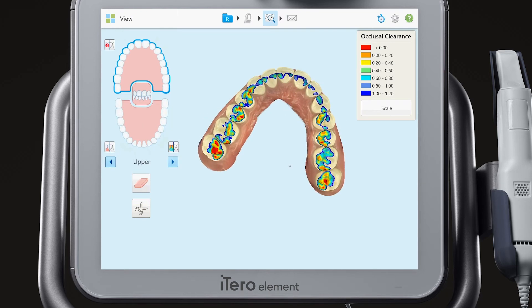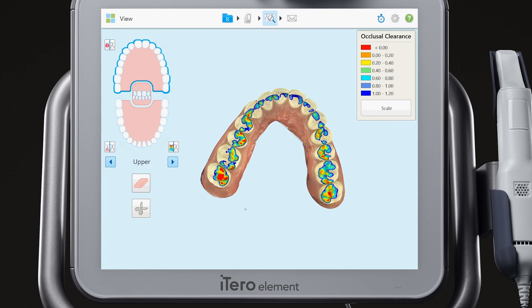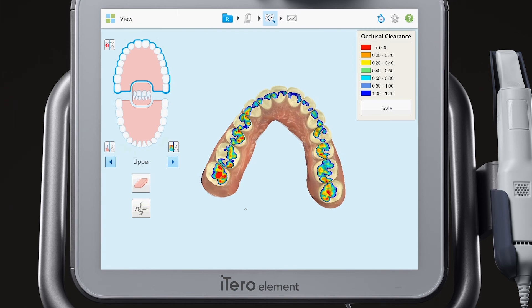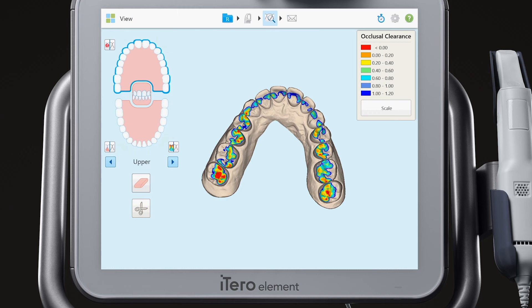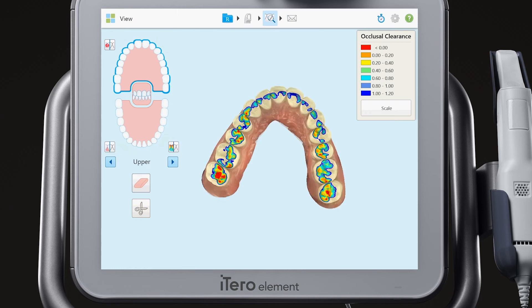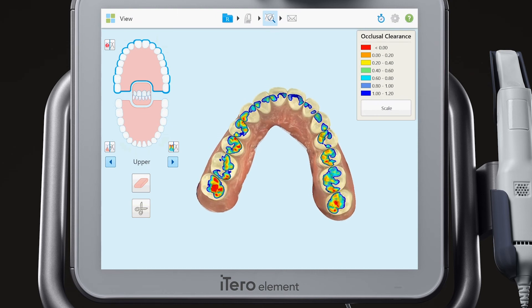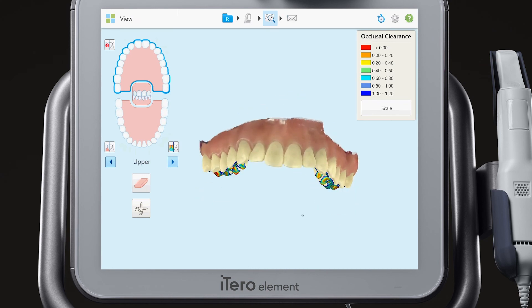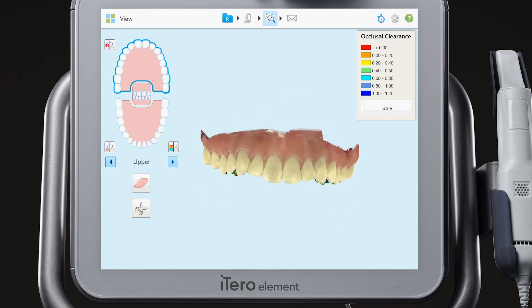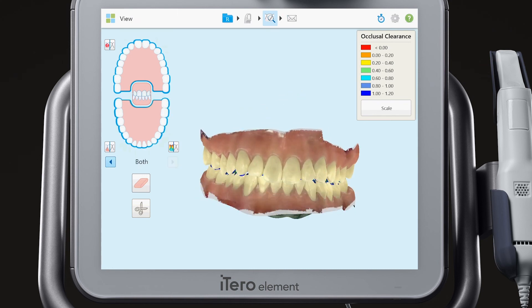Red will indicate full contact between the teeth. Extensive red areas may be a signal of excessive forces in the patient's occlusion, indicative of future tooth wear or possible fracturing. This tool can be used for productive chair-side education of the patient regarding their bite and appropriate treatment options.